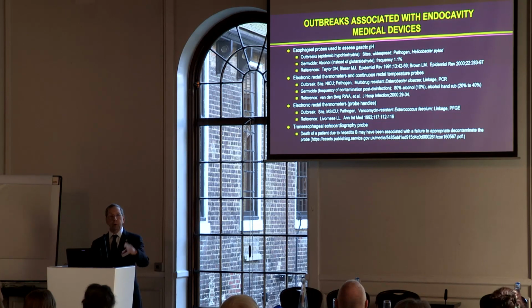Now, keep in mind, we didn't know Helicobacter pylori existed. We now know what they are in retrospect, but at the time it was unknown what the pathogen was causing these outbreaks. And the problem was that they were wiping the probes with a low-level disinfectant, or sometimes just soap and water, and these were quite extensive throughout the world. I've just listed for you a number of the references there, and these are really not necessarily individual outbreaks in these references, but lists of outbreaks.